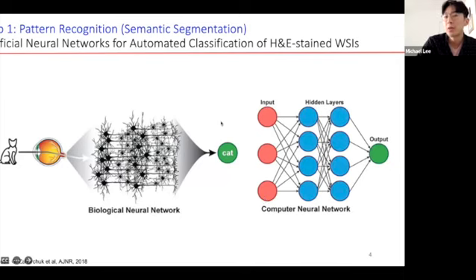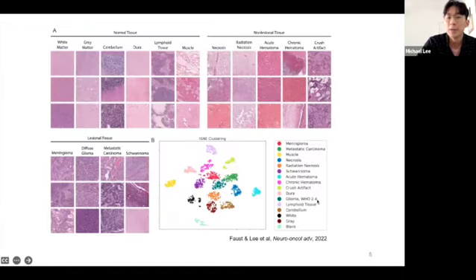Essentially, there will be an input like an image. In this case, there's an image of a cat, and hidden layers would detect things like edges and different features of this image to ultimately come up with an output or a classification. For digital pathology purposes, we would train them using different classes of H&E stained images, meaning different objects like white matter and gray matter that are present in the tissues of the whole slide images.